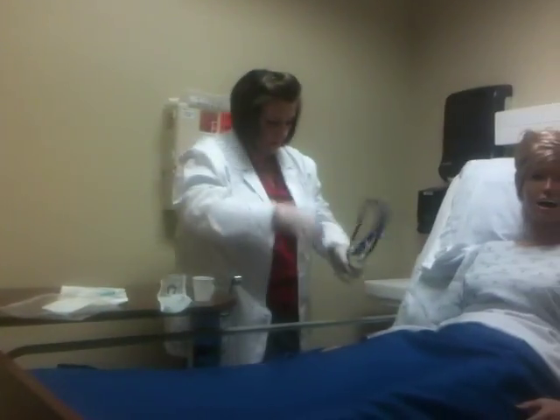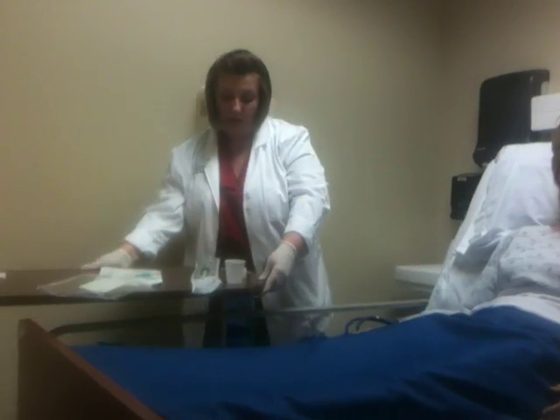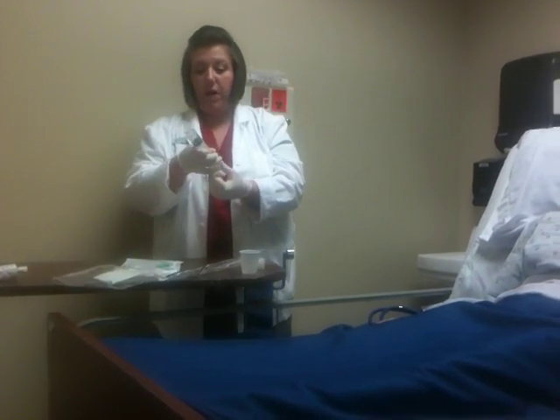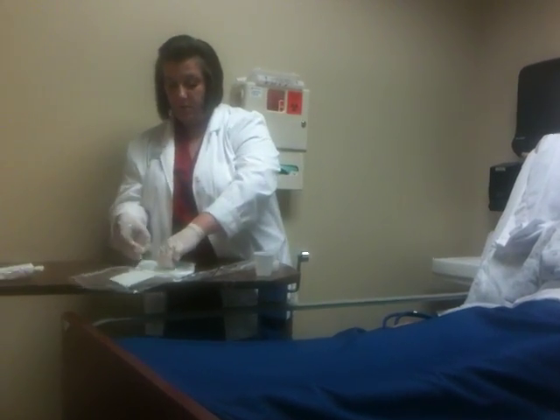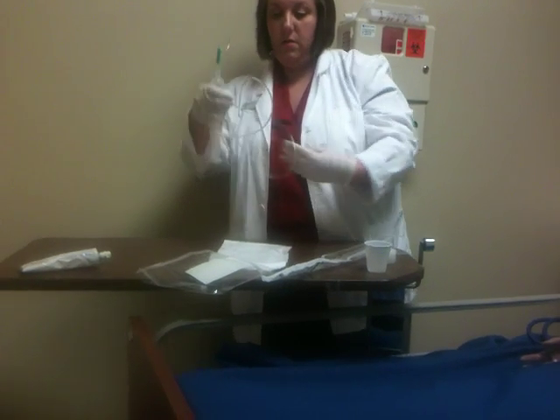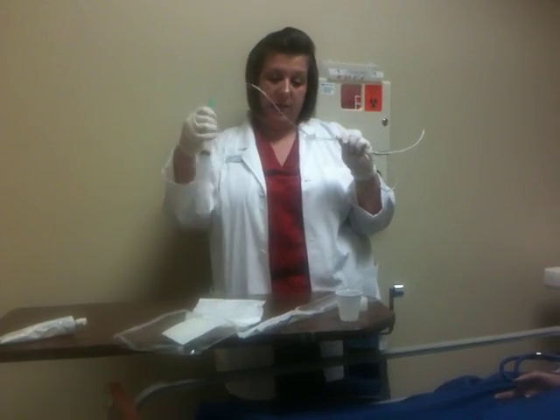I'm just going to sit it right here for me. Okay. And I'm going to go ahead and draw up 30 cc's of air and hook to my NG tube. This will kind of help when you insert it from gastric content coming out. So I'm going to go ahead and hook that to it.